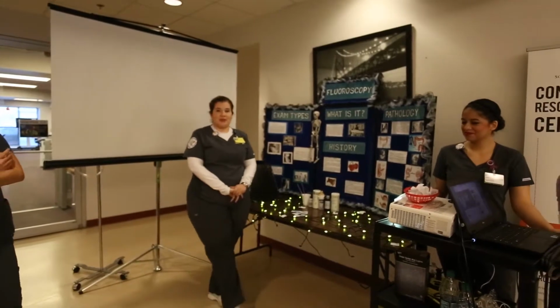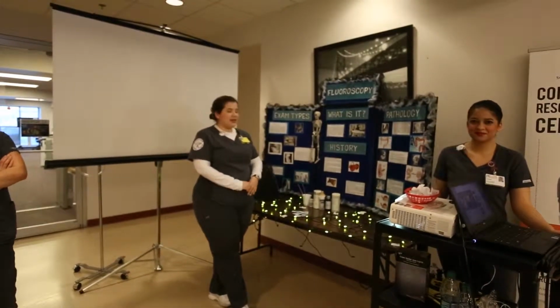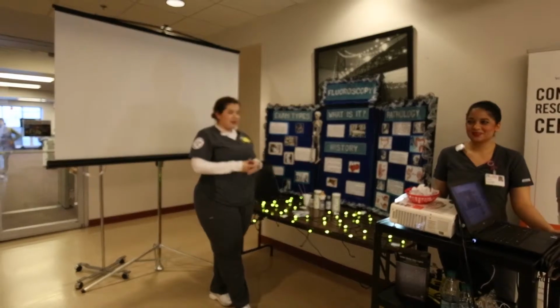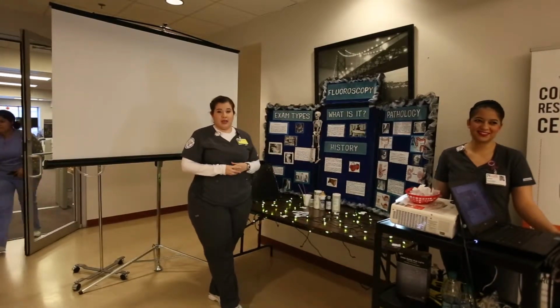Okay, so one of the aspects of radiology is fluoroscopy, and what it is basically is a live moving image, as opposed to your regular static images in X-ray. The purpose of it is actually to identify any kind of abnormalities in the function of the anatomy.